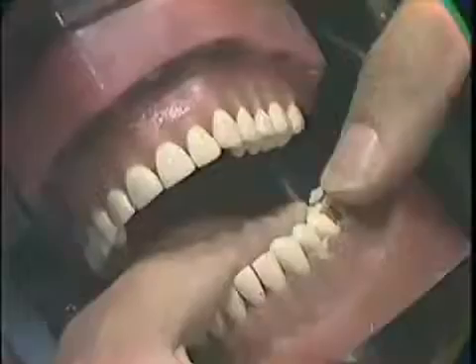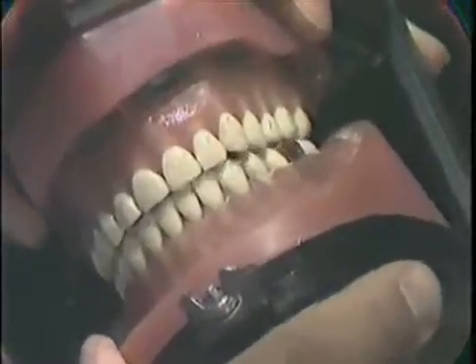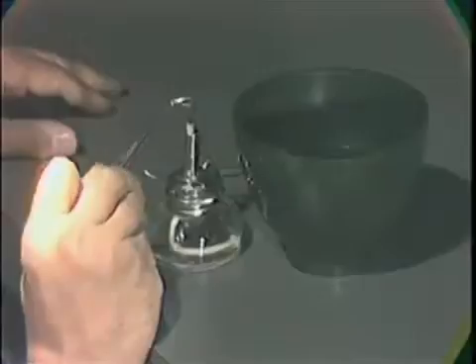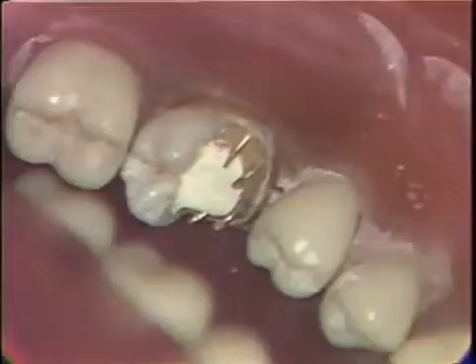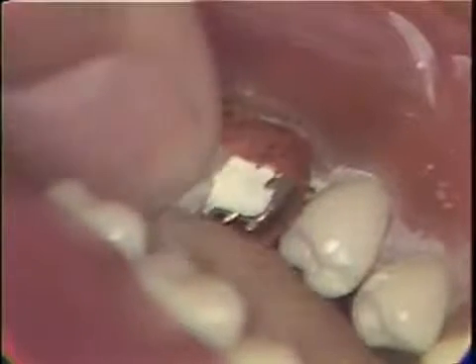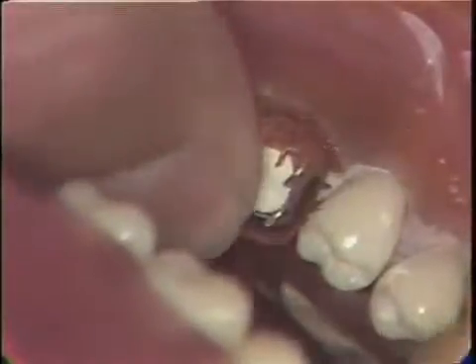The band is repositioned onto the tooth and the occlusion is again checked in all excursions to make sure the opposing teeth do not strike the band. The band can be annealed by heating it to a cherry red and quenching it in water or alcohol, making it soft and flexible. Some dentists prefer to work with an unannealed band which is a little stiffer. The soft band is re-contoured with a number one plastic instrument and burnished around and into the cervical area of the tooth.